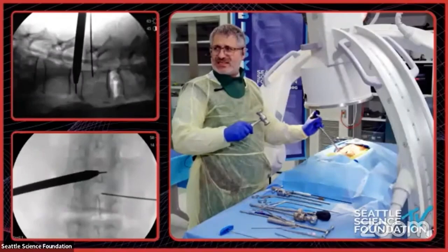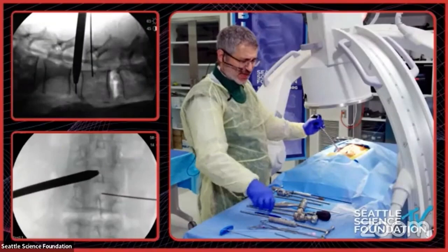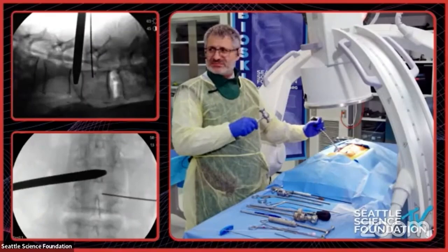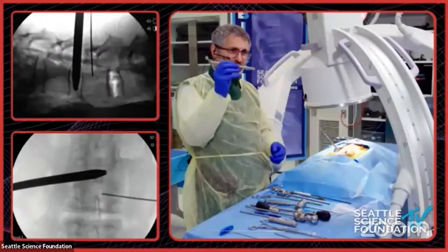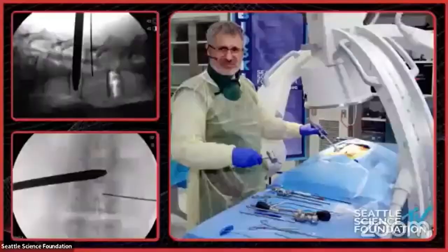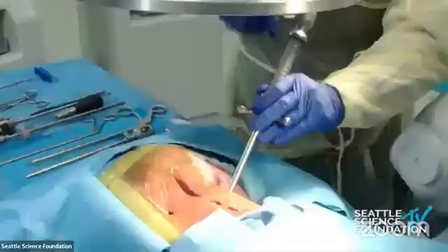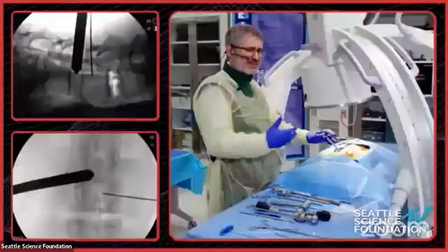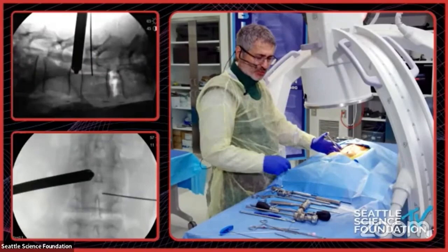This disc is a normal disc, and we all know that a normal disc is the hardest disc to remove. Once the K-wire is out, I pass the midline. You'll notice that already we achieve some physiologic or indirect decompression. The handle comes off. The tube — eight millimeter inside, ten millimeter outside — goes in with a rotating motion, I hammer it in. I'm at the epiphyseal ring, and then with one motion I get it in. Because this is a normal disc, the pressure of the disc itself is going to push it out.